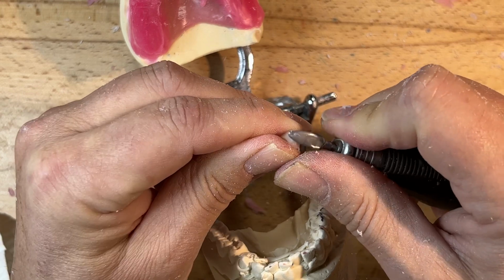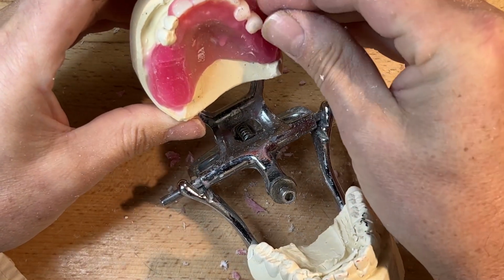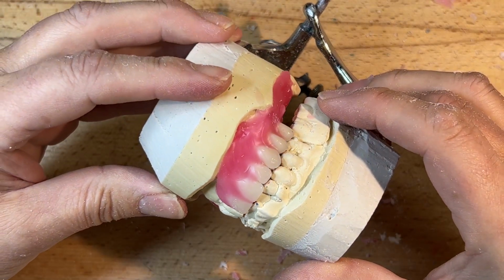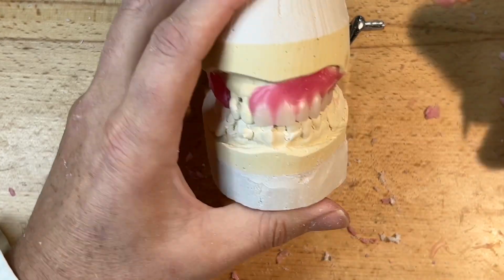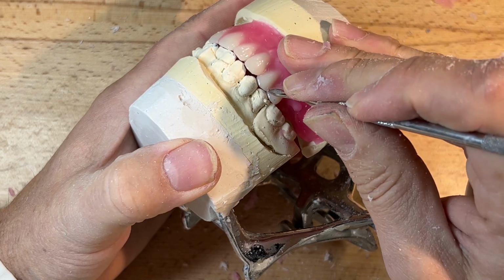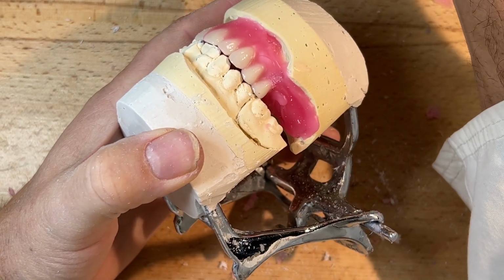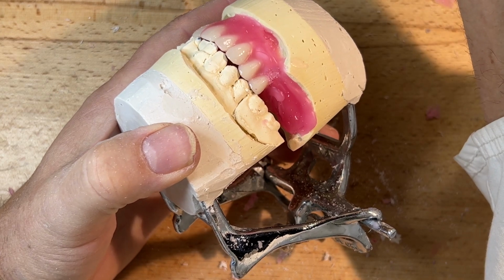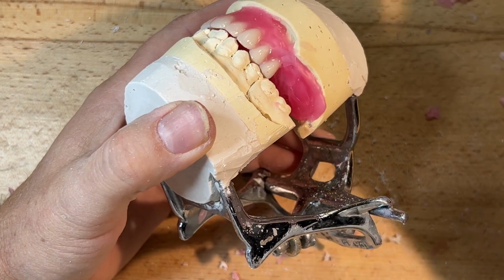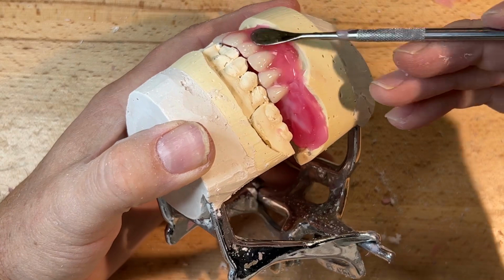It does have some merit, but I think with some good model analysis, good impression taking, right VDO, having the teeth in the neutral zone, we'd be able to minimize, if not eradicate completely, any type of hyperocclusion that causes denture instability. Again, I'm talking about the full upper, full lower, and here the full immediate upper against the natural lower, class 1 partial here.